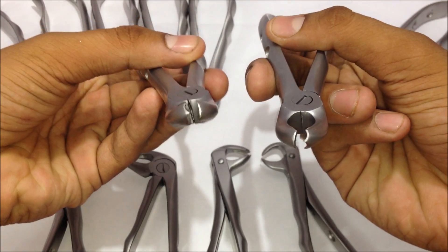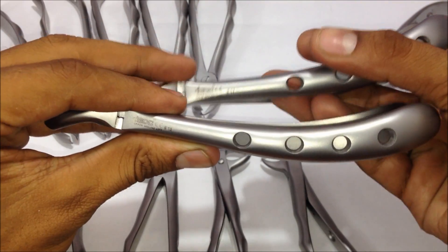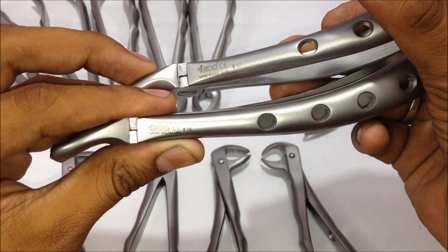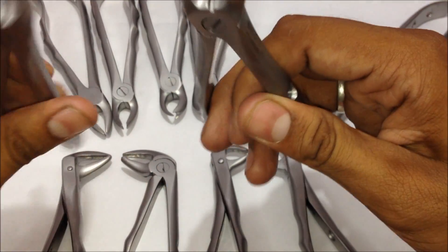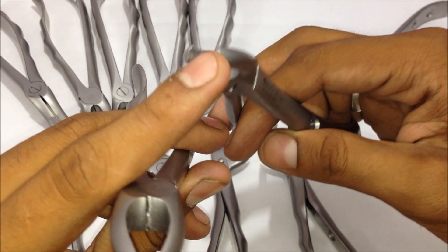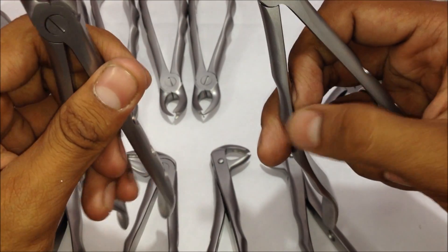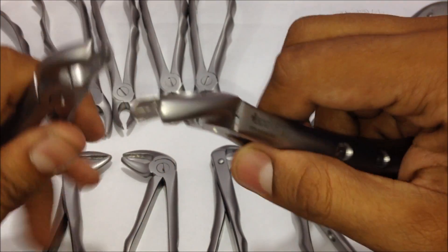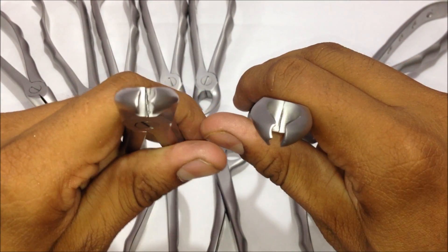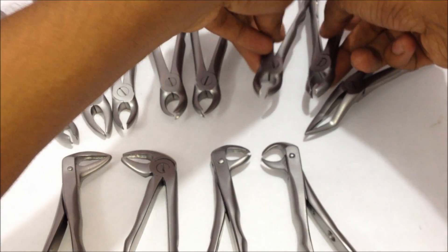Next are the number 17 and number 18 forceps, also for the upper molars — number 17 for the right molars and number 18 for the left molars. One side has a single sharp-edged beak and the other side is a curve that sits onto the curve of the tooth, near the cervical area, providing extra grip support for extraction. Both have almost the same function but are for opposite sides.